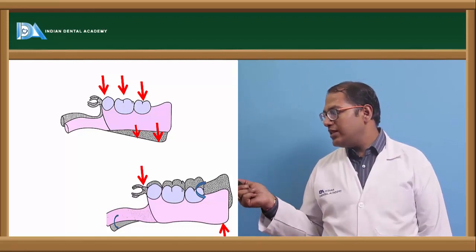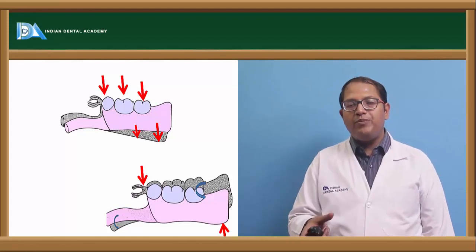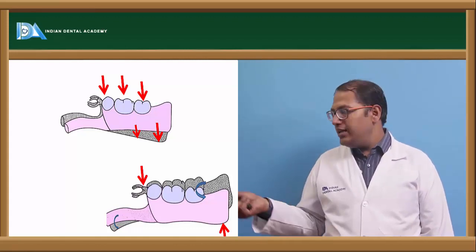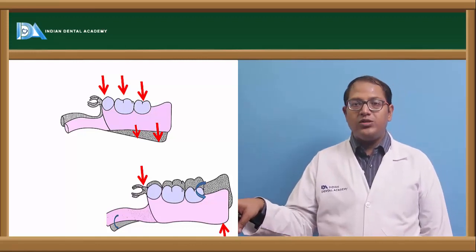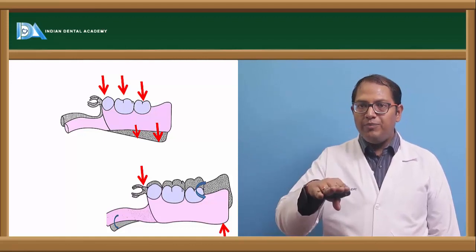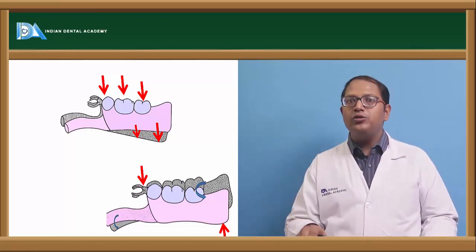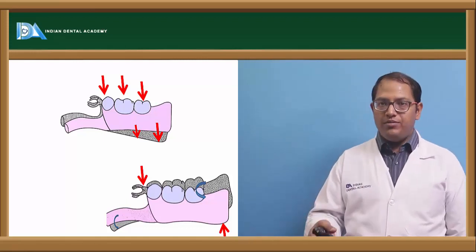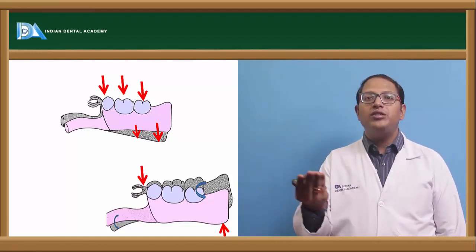In those cases, when a rotating force acts, the force goes onto the abutment tooth and it is going to tip. If there were another rest to support it, then if the denture wants to get up, it will not allow it, it will push it down. So it is increasing the lever arm, increasing it away from the area of the fulcrum.